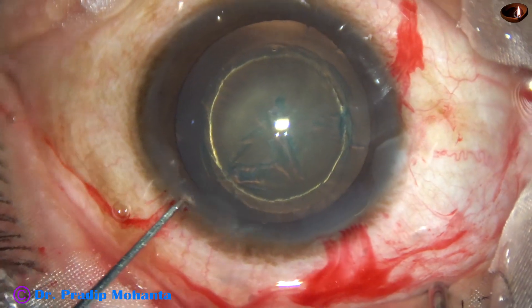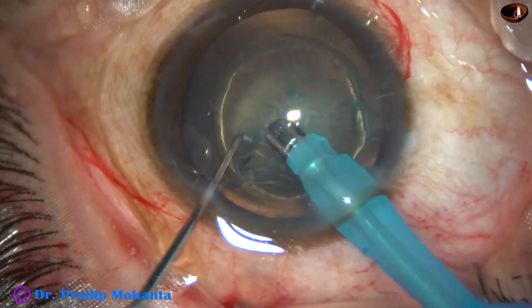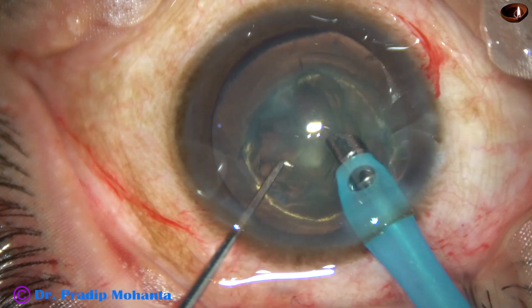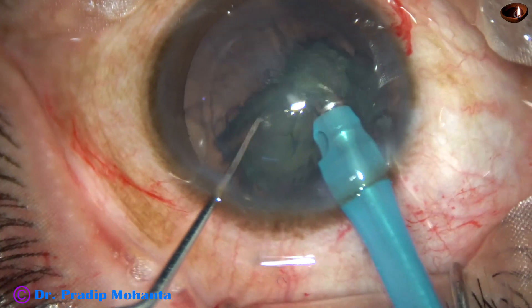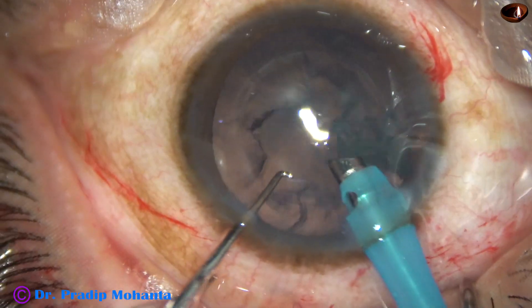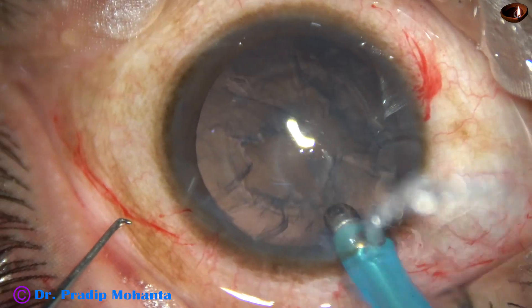Now watch phacoaspiration. Just go down into the anterior chamber and start aspirating the lens matter. No ultrasonic energy is required — just vacuum. I have used 450 mmHg vacuum to remove this lens matter.